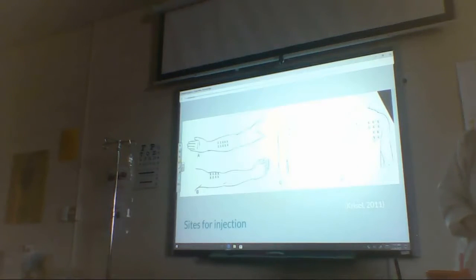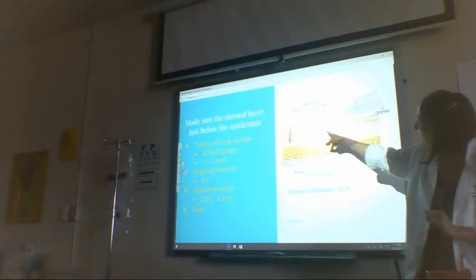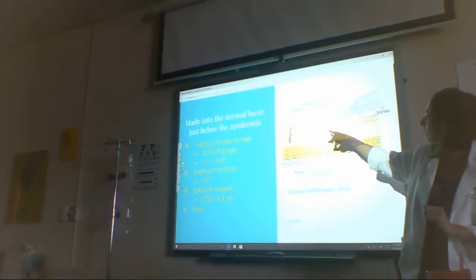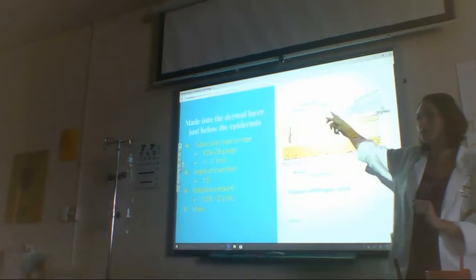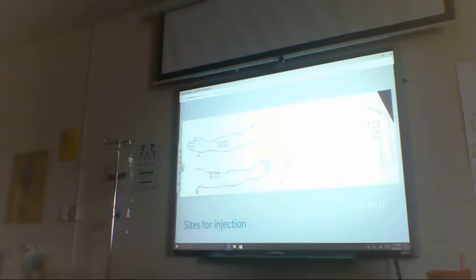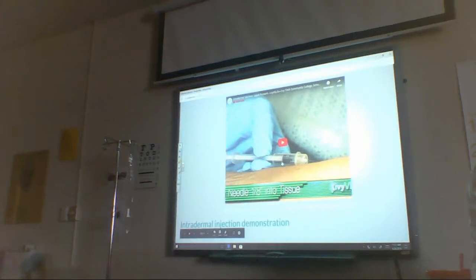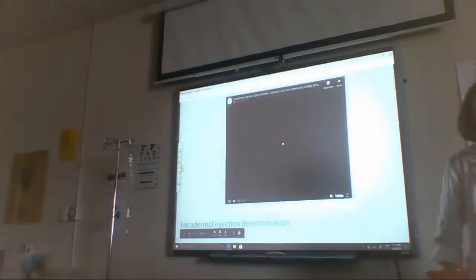And I think it was on the previous slide. Just remember, when you're instilling the medication, you want to get the nice little hump there as you inject it, and that's called a bleb. It always makes me think of how dogs talk, blebs and blims. But all right, so I've got a brief little video for you on how to do the intradermal injection.